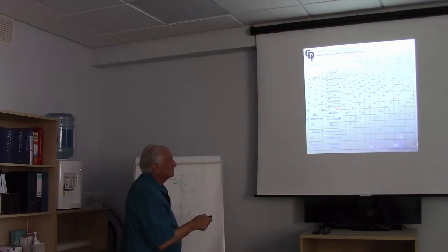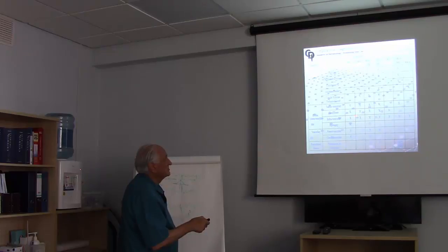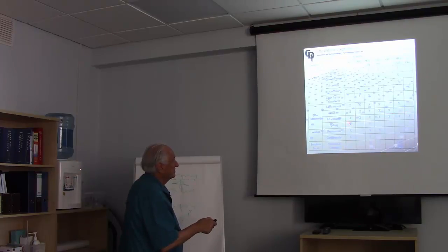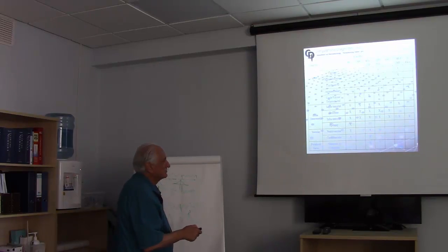The brain, supratentorial, EEGs, EMGs, so forth, motor potentials. Skull-based cases, we tend to use almost everything. We may use motor potentials also, but you're going to use EEG, EMGs from most of the cranial nerves, upper extremity responses, lower extremity responses, brainstem potentials, and so forth. Infratentorial, again, you may use everything. Epilepsy, you may use only EEG. Vascular cases, EEG, upper extremity evoked potentials, lower extremity evoked potentials, and motor potentials.